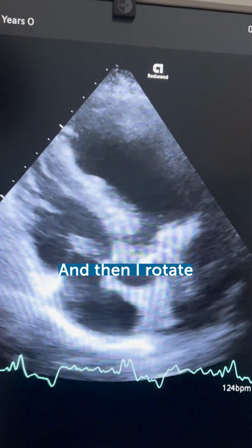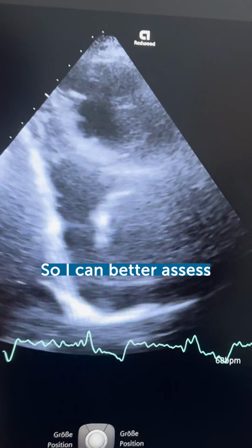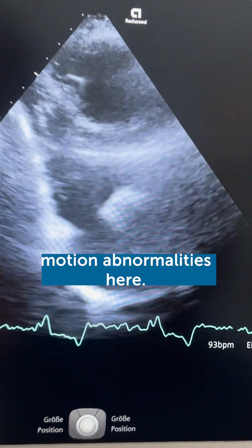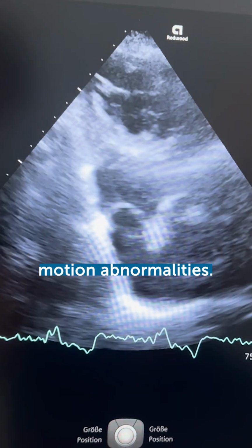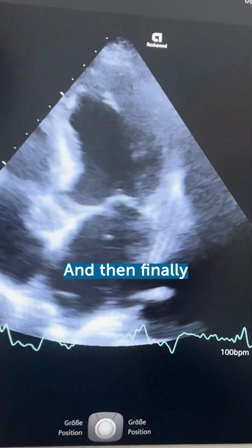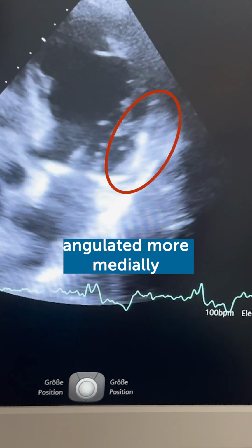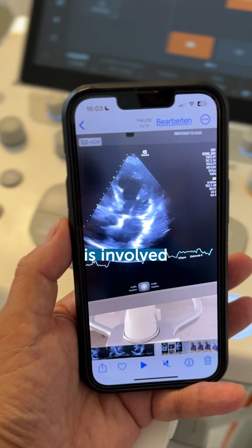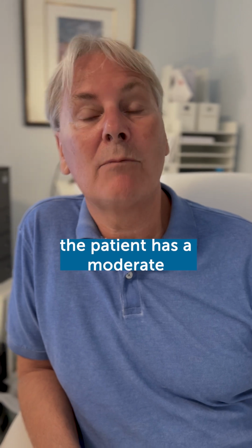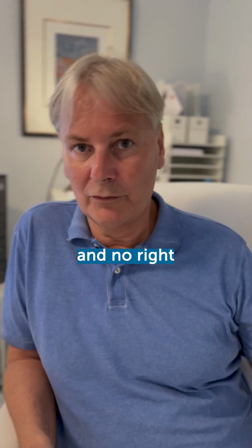And then I rotate around the right ventricle to an inflow-outflow view so I can better assess the wall motion abnormalities here. In this case, the patient has a normal-sized RV with no wall motion abnormalities. And then finally, I go back to the four-chamber view, angulate more medially to look at the lateral wall because I also want to know if the lateral wall is involved. In this specific case, the patient has a moderate-sized inferior infarct with moderate MR and no right ventricle involvement.